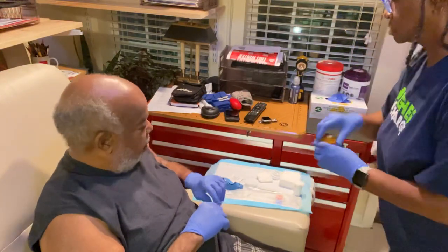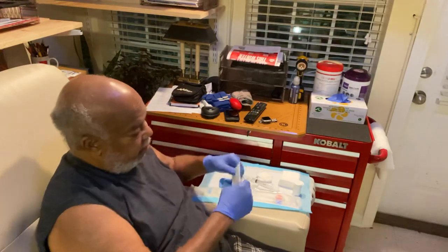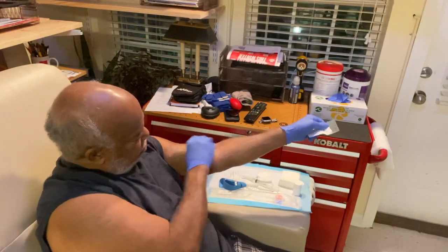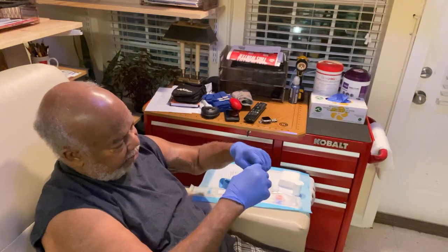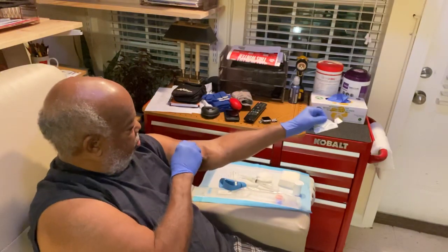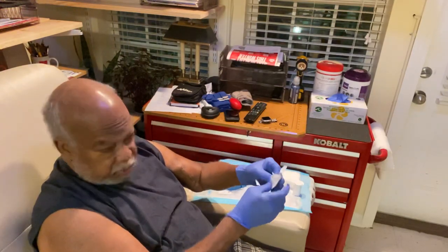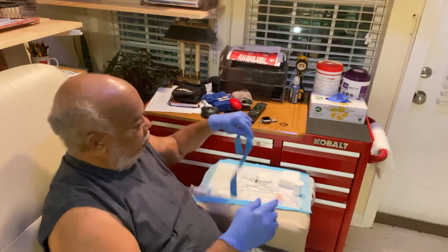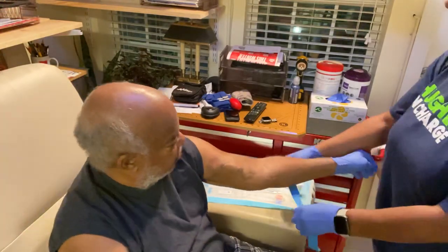Our heparin bolus is prepared. The first step — by the way, I need to say that this fistula has been washed thoroughly prior to the beginning of the treatment, and we now use the alcohol swab to add additional cleaning to the spot that we hope to achieve our stick.